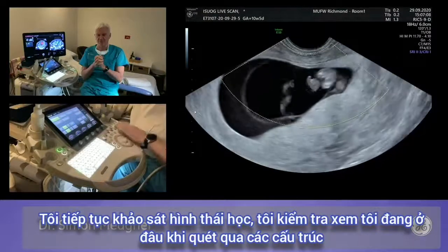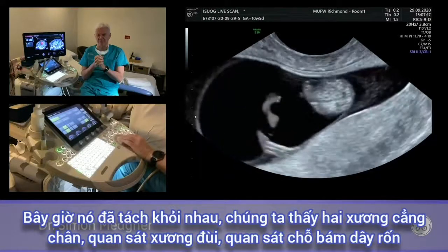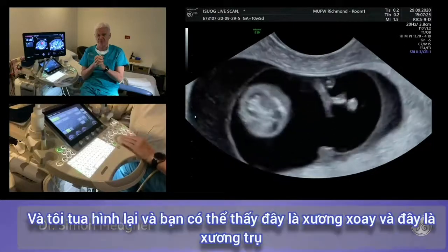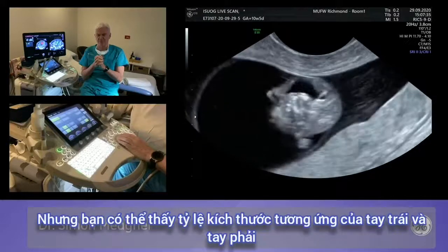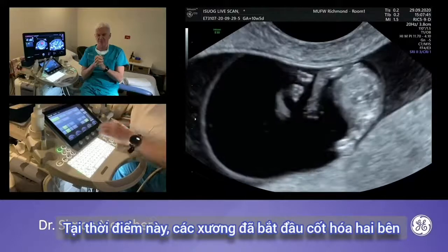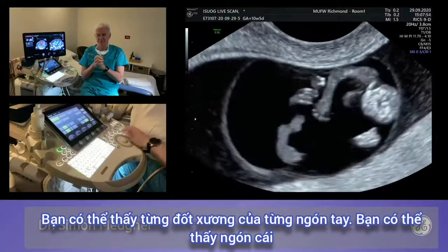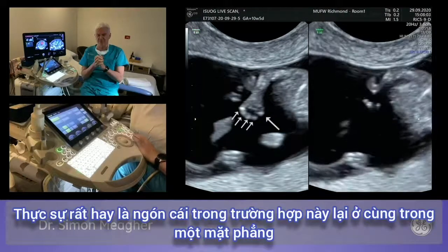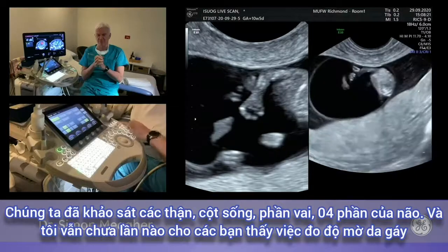Continuing the anatomical survey: baby's legs and feet — actually separated now. We've looked at the femur, cord insertion, stomach, four chambers, and outflow tracts. Now the humerus and radius and ulna — you can see the radius and ulna in proportion, and the size of the right and left arm. Moving up to the humerus: at this stage the bones are really beginning to ossify. Using dynamic range adjustment, you can see the individual bones of the fetal fingers — the thumb, tips of the digits — with the thumb visible in a single plane. Kidneys, spine, shoulders, and the four sections of the brain have all been covered. Nuchal translucency has not yet been measured.